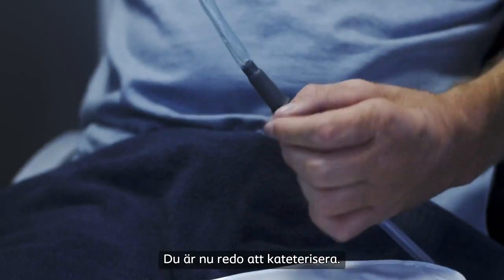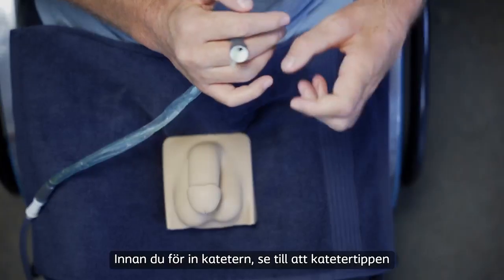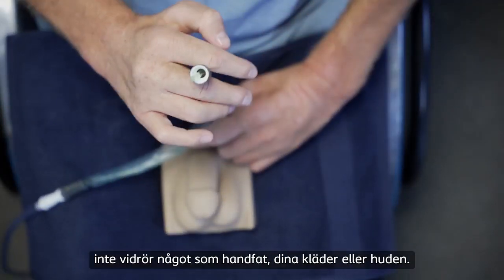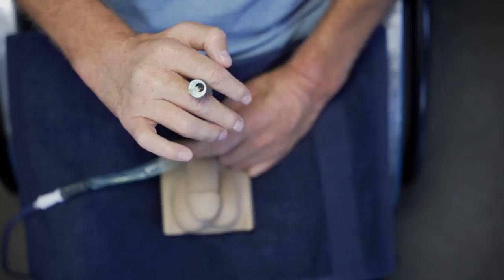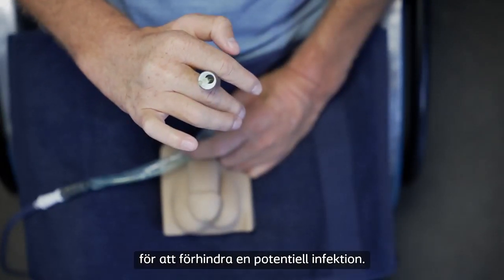You're now ready to catheterize. Before you insert the catheter, make sure the catheter tip doesn't touch anything like the sink, your clothes, or skin. If it does, you must use a new catheter to prevent a potential infection.